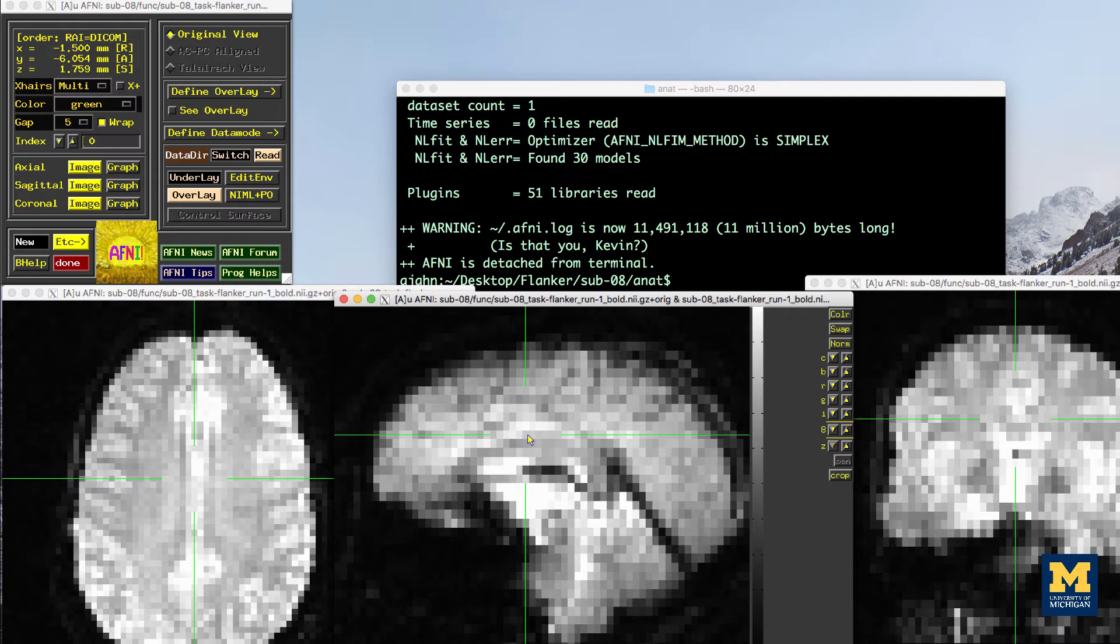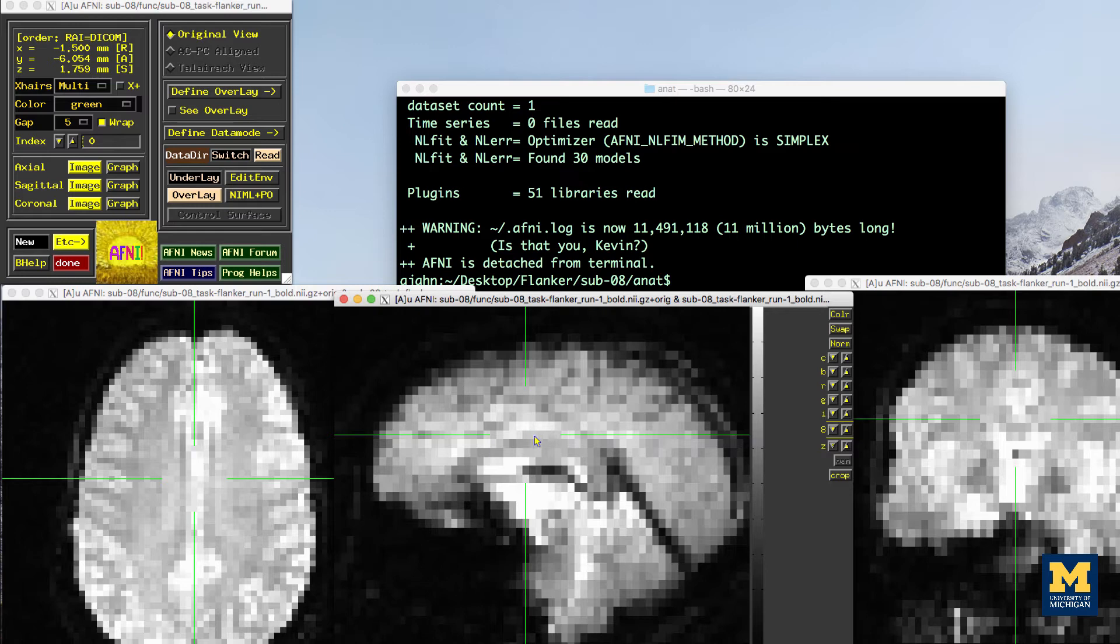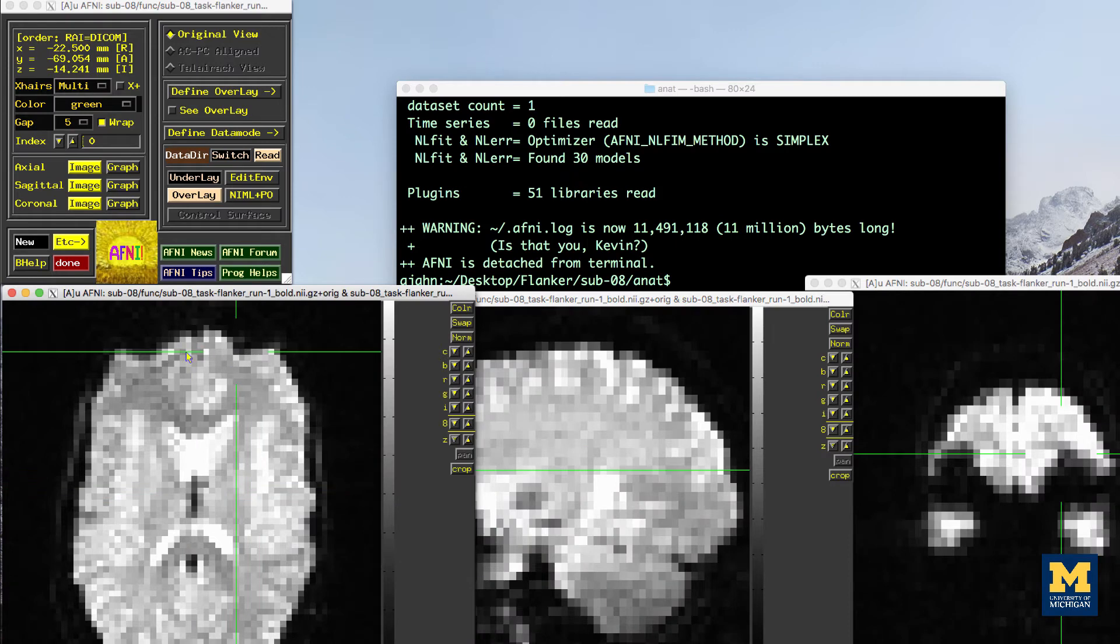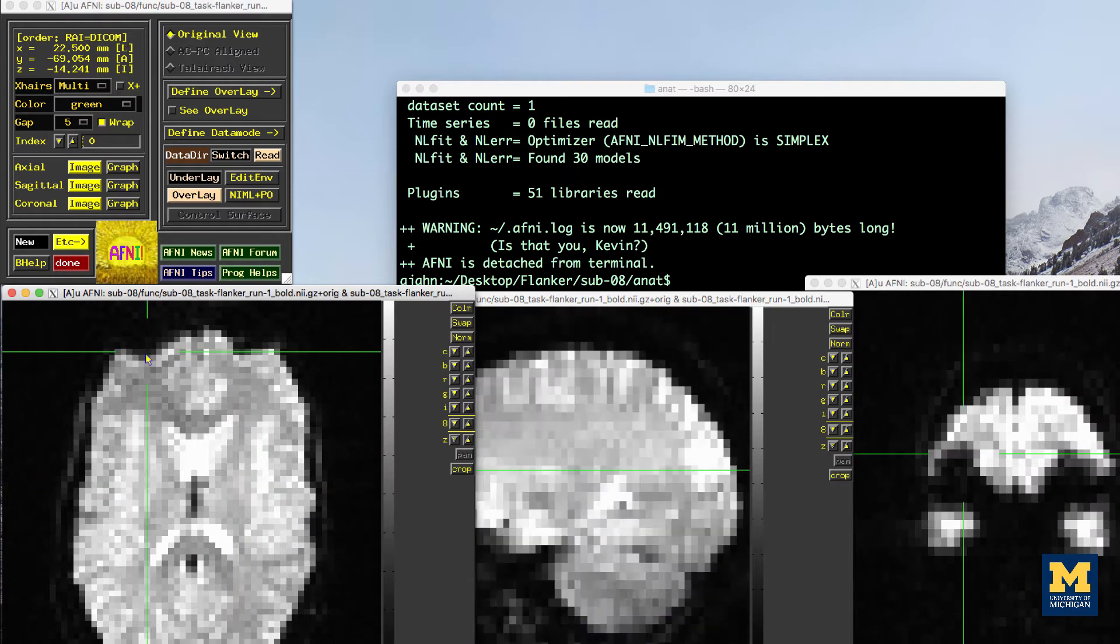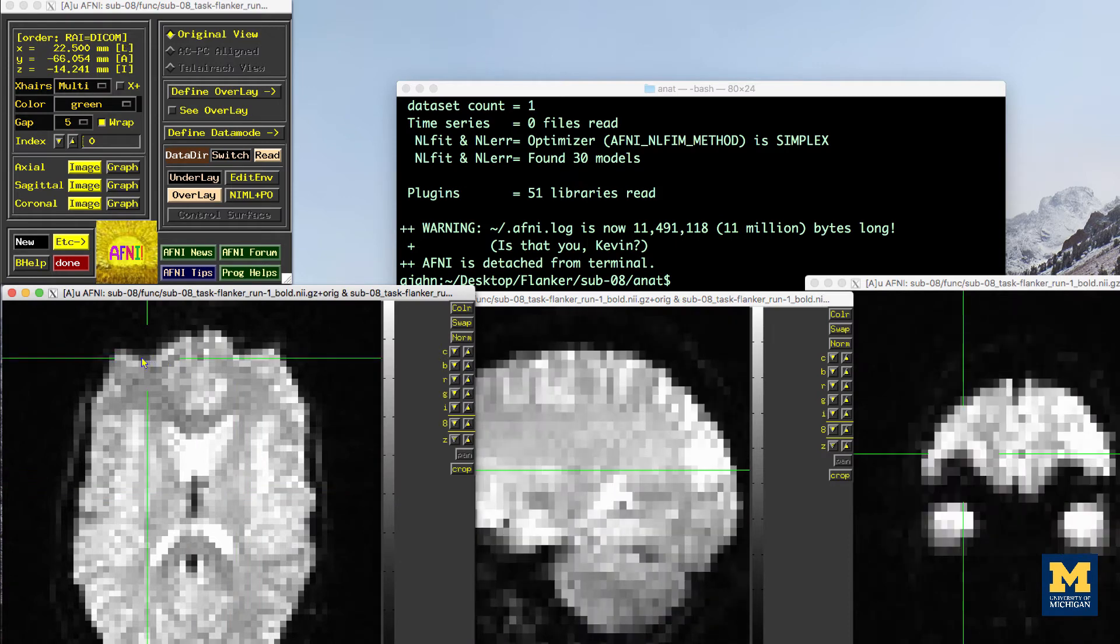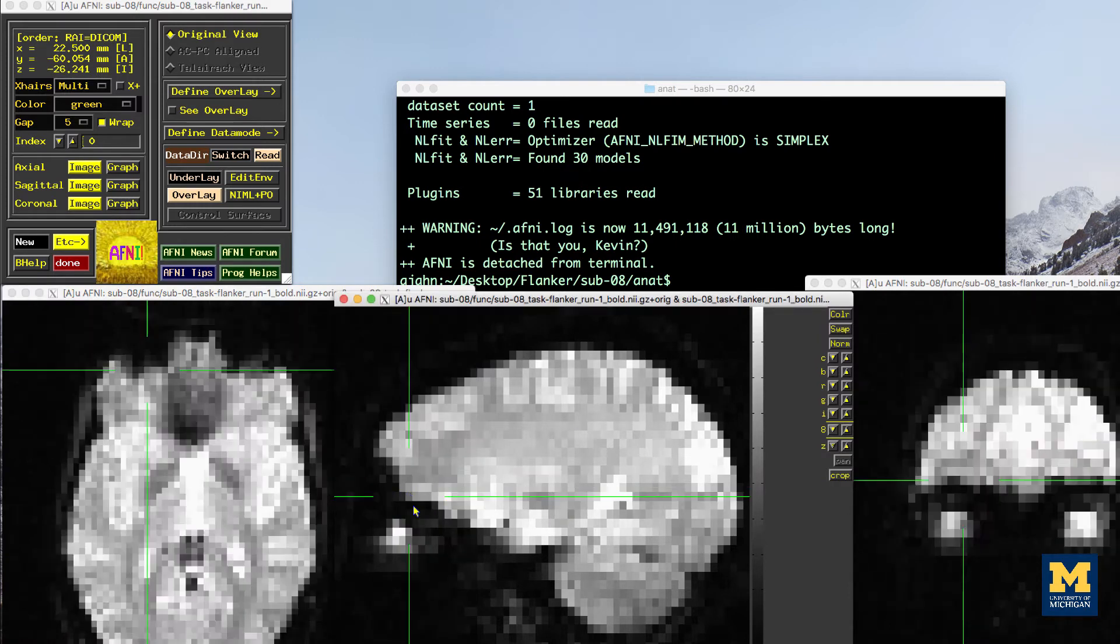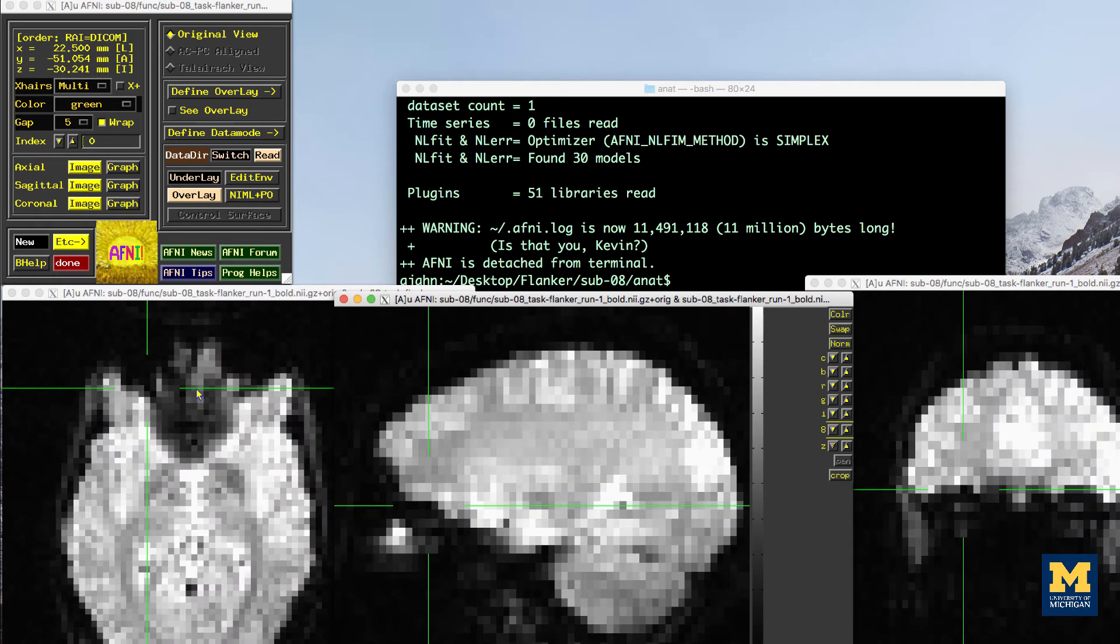Many of the quality checks for the functional image are the same as with the anatomical image. Watch out for extremely bright or extremely dark spots in the gray or white matter, as well as for image distortions, such as abnormal stretching or warping. One place where it is common to see a little bit of distortion is in the orbital-frontal part of the brain, just above the eyeballs. There are ways to reduce this distortion, but for now we will ignore it.